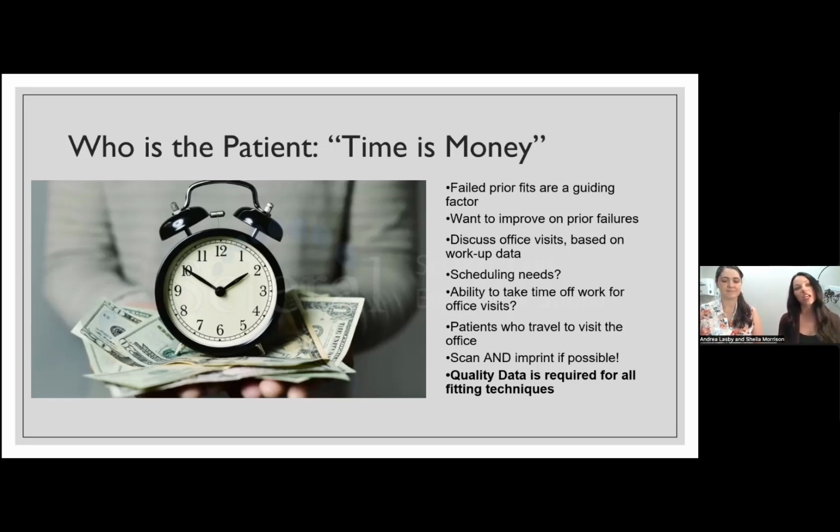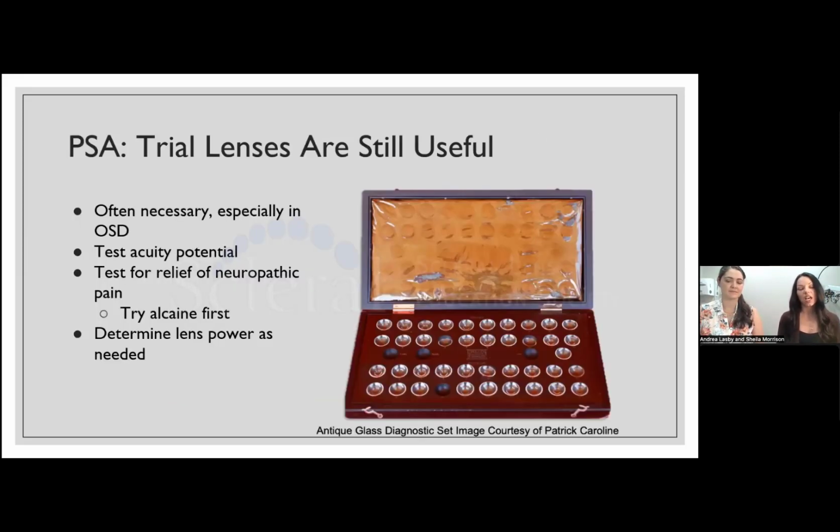So if you are doing any digital scanning or impression based, I'd always recommend to do them both on the same day. And remember, whatever it is that you're using to measure your patient to build lenses, especially empirical design lenses, quality matters. You have to make sure that the data that you're putting into the system is good. Otherwise, the data that comes out of the system is not going to be good.